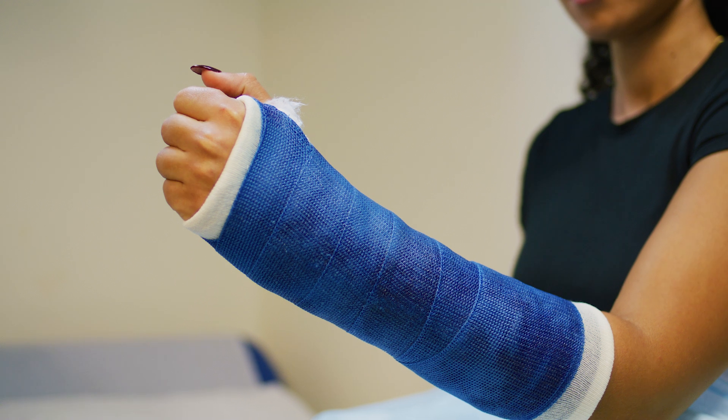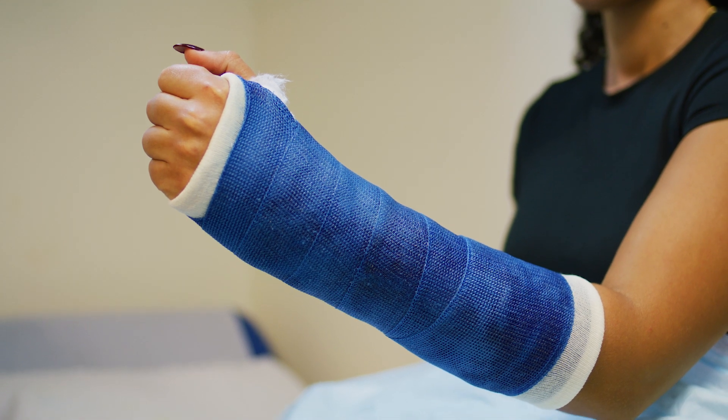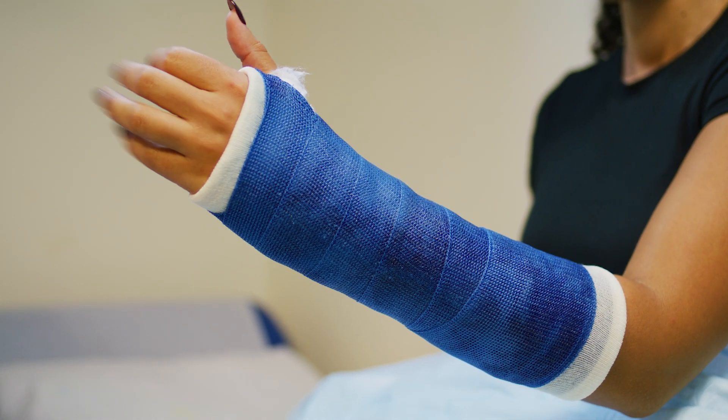Casts are used to protect and keep bones and joints from moving while they heal from an injury or surgery. Casts are made from fiberglass or plaster, forming a hard, supportive layer around the healing area.